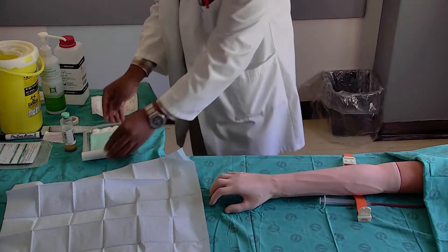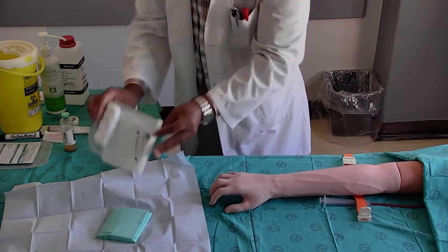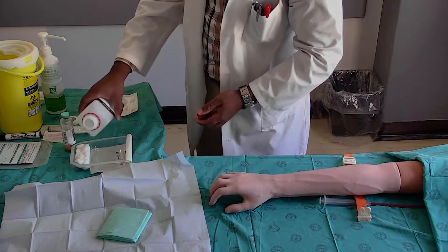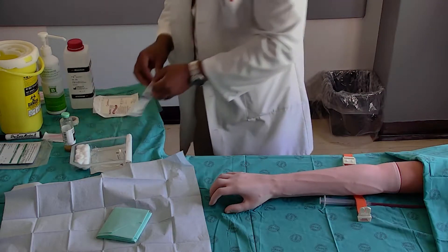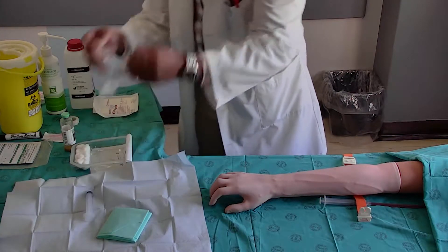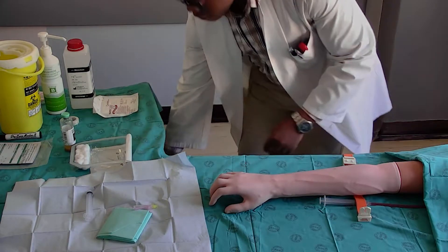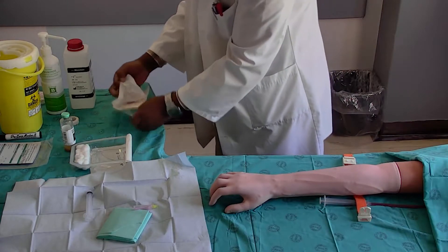Empty the remaining contents from the sterile pack onto the sterile field. Pour the iodine solution into the fluid recess on the sterile pack tray. Open the syringe and needle onto the sterile field. Open the sterile gloves away from and not onto the sterile field.